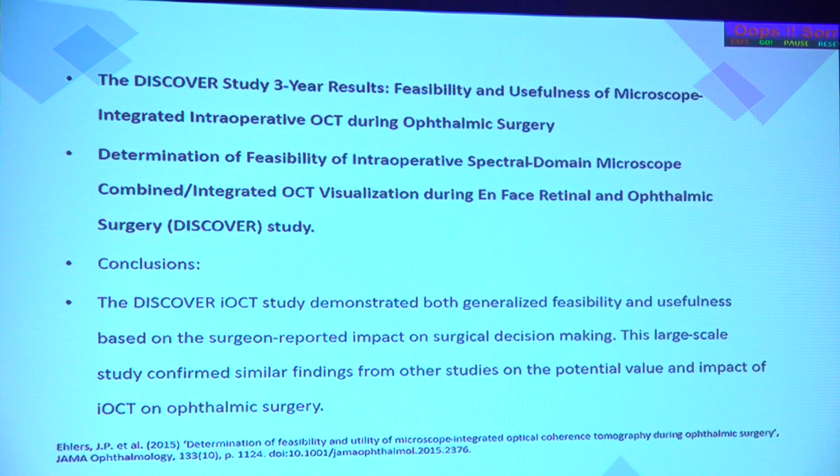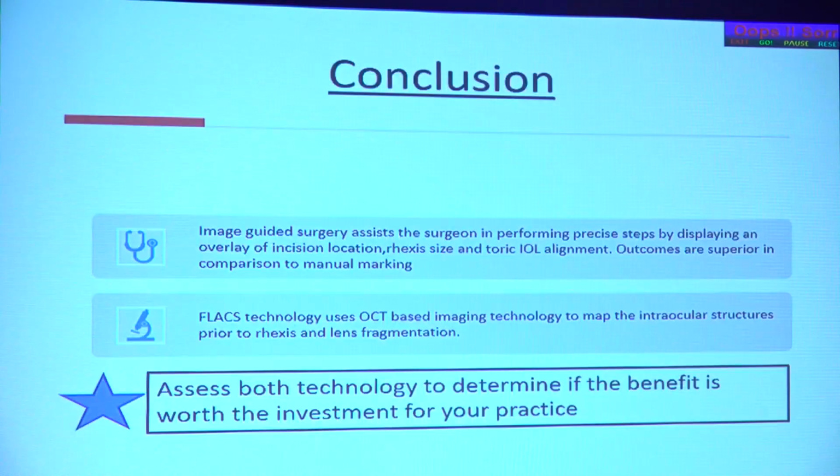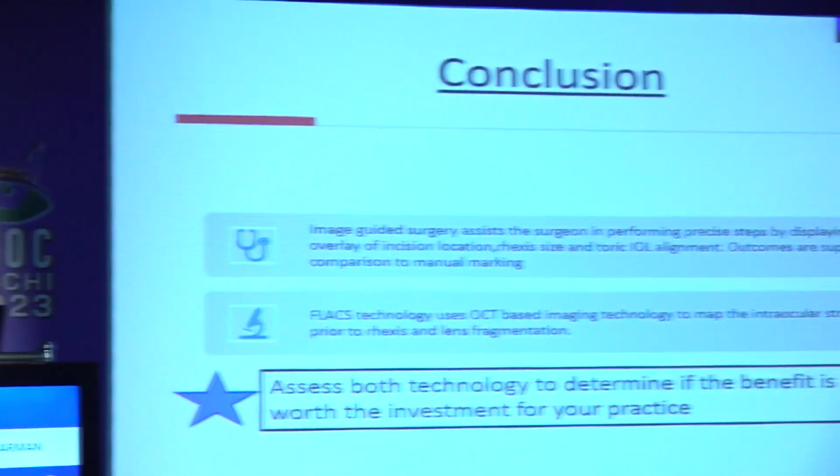Again, this is another study on intraoperative OCT for VR surgeons. It confirmed the feasibility of it and ensured that the patients had a better outcome. And also, if you are a cornea surgeon, this helps you to do penetrating keratoplasties. You can have better confirmation that the graft and host junction are well adhered. In lamellar keratoplasties, you can ensure that the lamella is well attached to the cornea. All can be seen by intraop OCT as well.